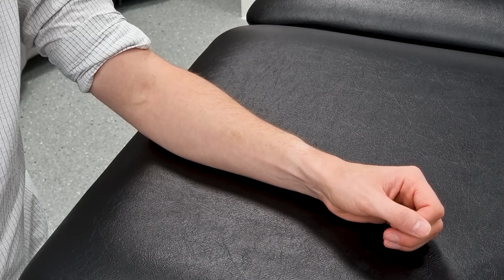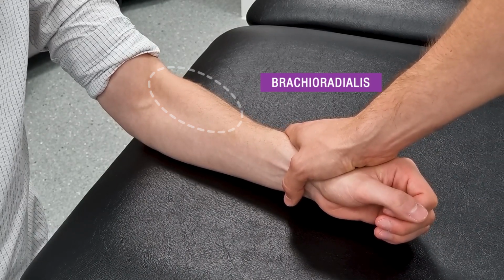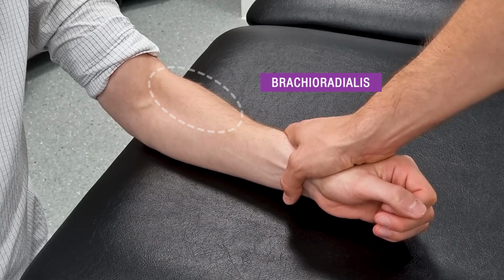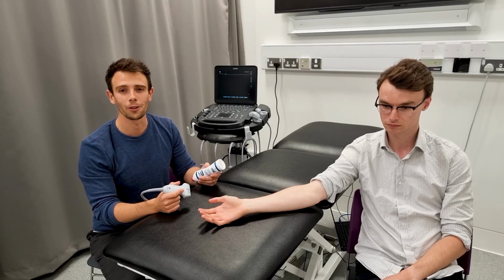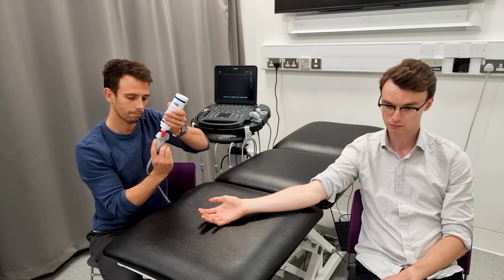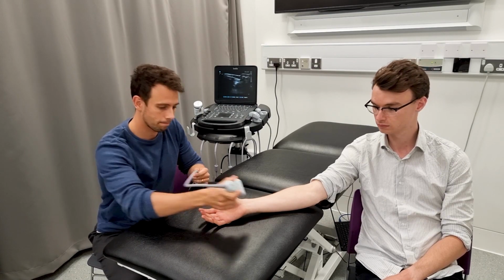Finally, when flexing the elbow under some resistance, the brachioradialis can be easily seen and palpated. This muscle originates on the lateral supracondylar ridge of the humerus and inserts onto the distal radius. This muscle forms the lateral border of the antecubital fossa. We'll now be using ultrasound to look at the wrist, hand and forearm. To begin with, we'll place the probe at the base of the wrist.